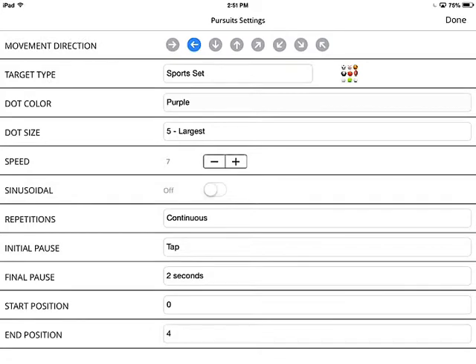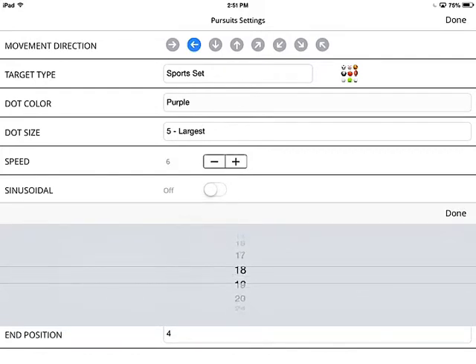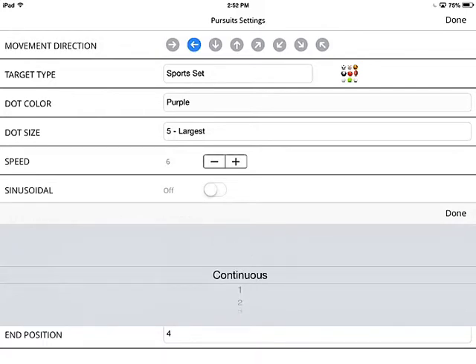You can also change the speed of the pursuit — let's make it about a 6. You can turn sinusoidal on or off, which means the movement will reverse, going from the initial position to the end position and then back and forth. Let's keep that off for now. Repetitions can be continuous or set from 1 up to 100. Let's keep it on continuous.